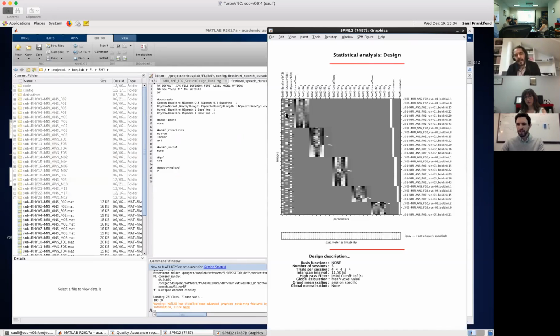I have to look at the code to be able to answer that question. So we want to be able to do both things. We want to be able to enter those parametric modulators and remove any potential covariation in the BOLD signal that covaries with duration and not with things that we care about. But we want to be able to do it in two potentially different ways. One that actually controls for potential difference in the duration across the two conditions that we care about, and one that does not orthogonalize with respect to potential difference in duration across the two conditions of interest.